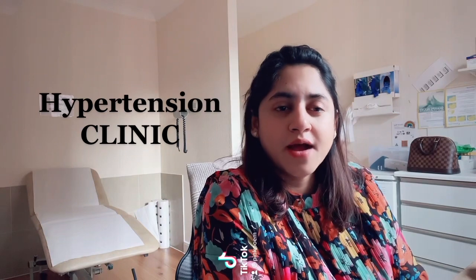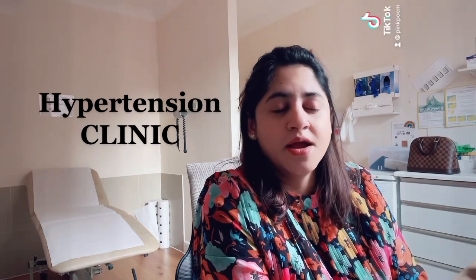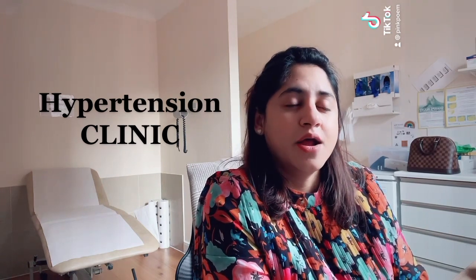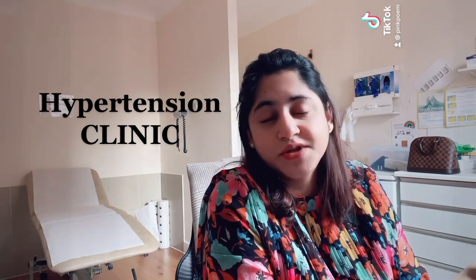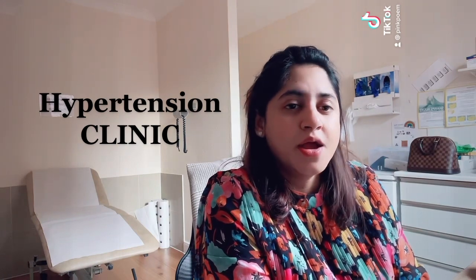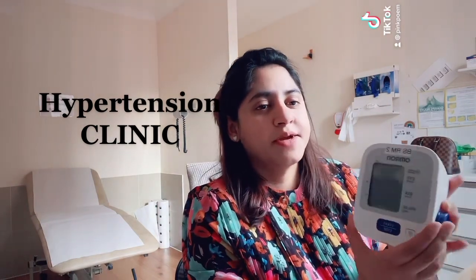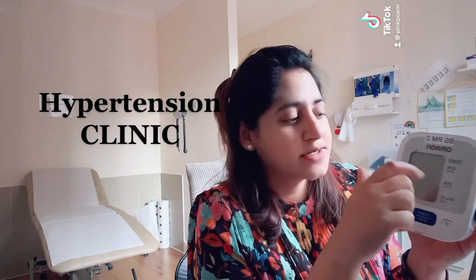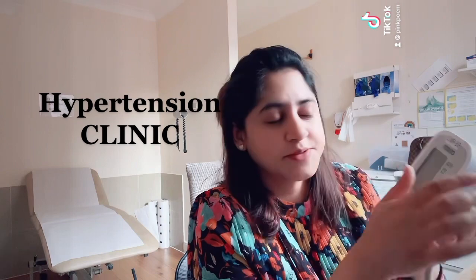So while running a high blood pressure, like hypertension, clinic, what is usually suggested to patients is to monitor your blood pressure at least 3 times a day ideally, but if 3 times a day is not convenient for you, go for once daily or twice daily. As you can see in this electronic machine, this is the systolic. The systolic is when the heart contracts, diastolic when the heart relaxes, and pulse is the rate of the heart.